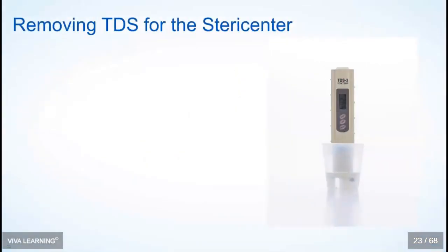When we want to remove those totally dissolved solids for use of the water in the Steri Center, we're often using, like I said, distilled, deionized, but hyperfiltered water can be a little bit more user-friendly. Hyperfiltered water can go through a reverse osmosis process, then following other filtrations to remove any additional solids. Because what we know is water is the universal solvent.